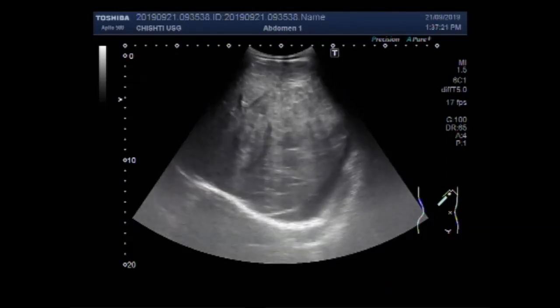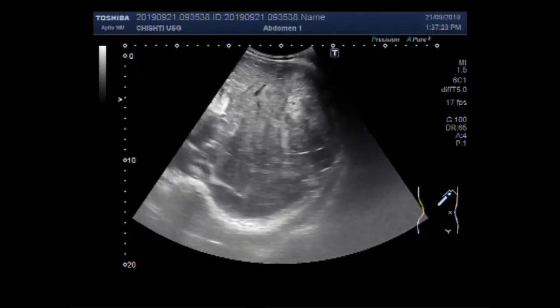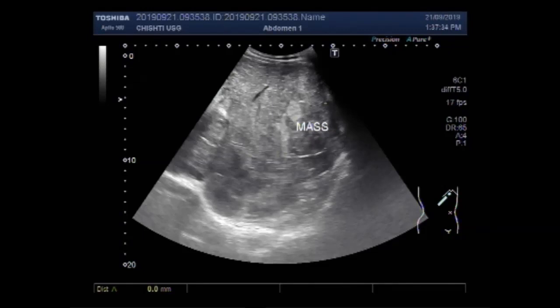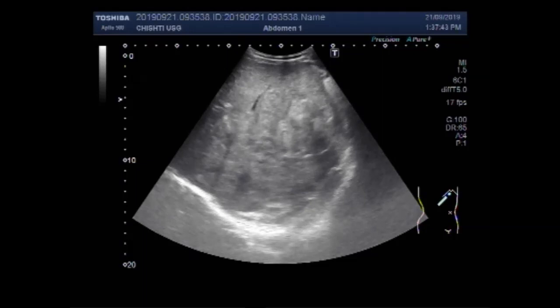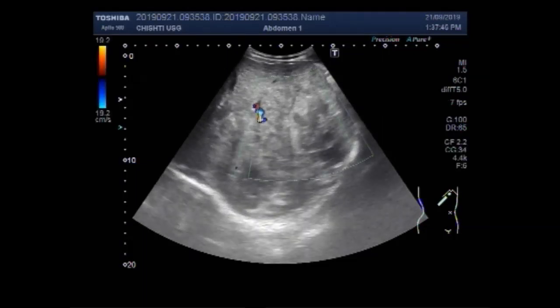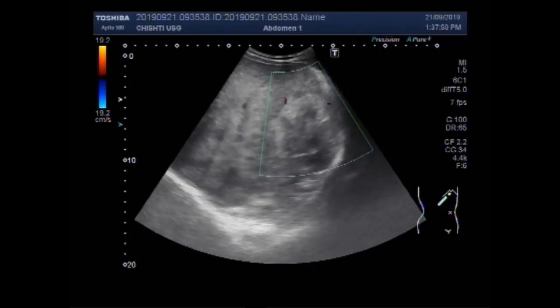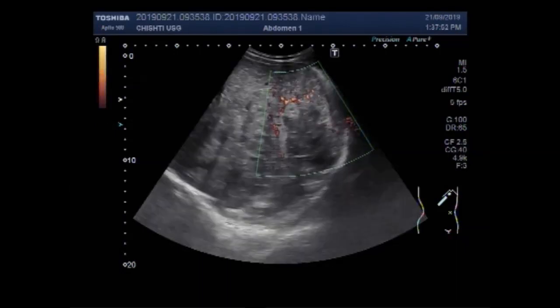Now you can see a hepatic mass in the right lobe of the liver. This mass measures about 64.6 millimeters by 56.6 millimeters. The mass is round to oval in shape, semi-solid to solid in consistency, and slightly heterogeneous.